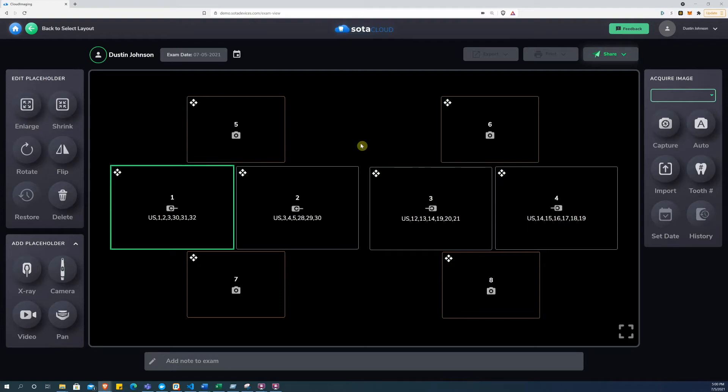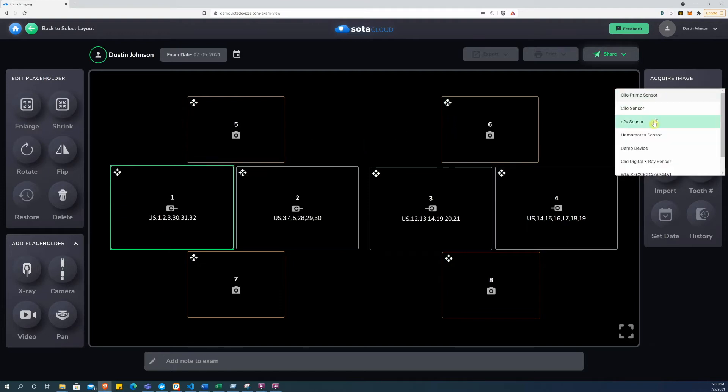Start by picking a device from the device drop-down menu. For this demo, I will use the demo device.